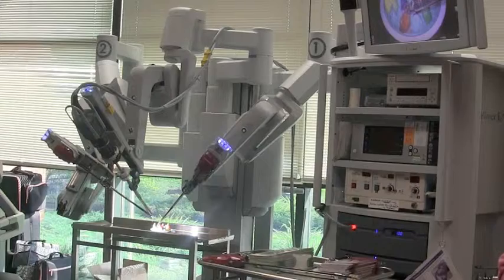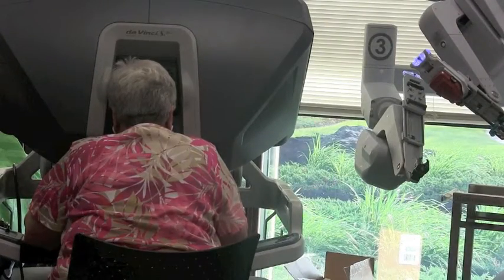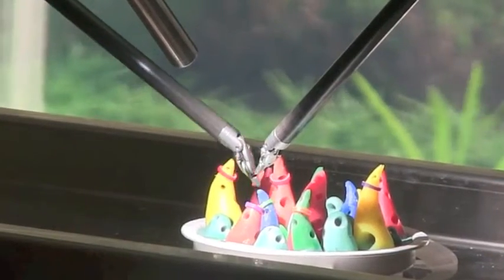It takes a little bit of practice, to be honest. This robot here is only using three arms, but there's a fourth arm you can actually use, so it essentially doubles the number of arms that I get to use as a surgeon.